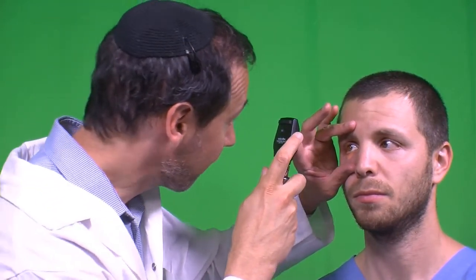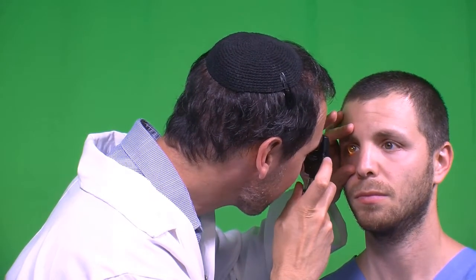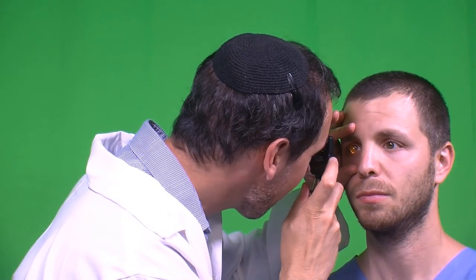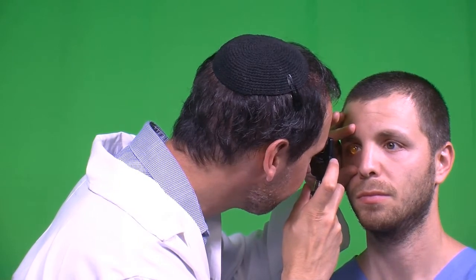Important is what I'm doing with my left hand, and that's to stabilize it on the patient's eye area. I'm putting my left thumb underneath his eye, on the cheekbone almost, and my fourth finger right over the eyebrow. And I'm extending out my index finger, which is going to make contact and help me stabilize my direct ophthalmoscope. After that, I'm going to now proceed to look through the direct ophthalmoscope and focus in on the iris and the conjunctival vessels and make sure that everything looks normal.